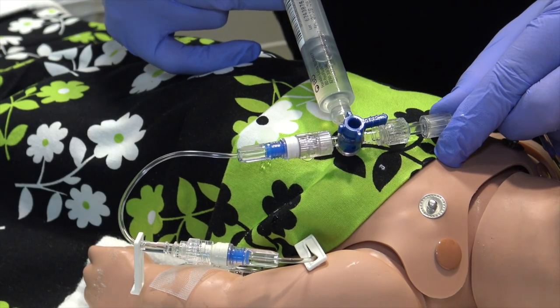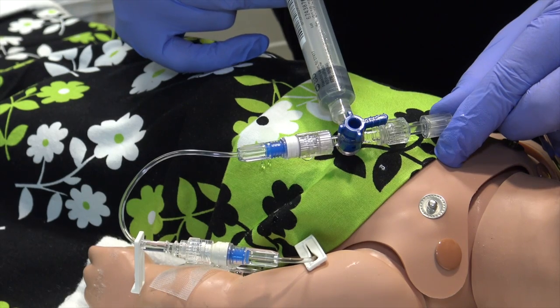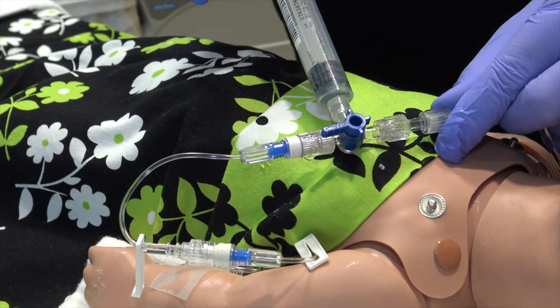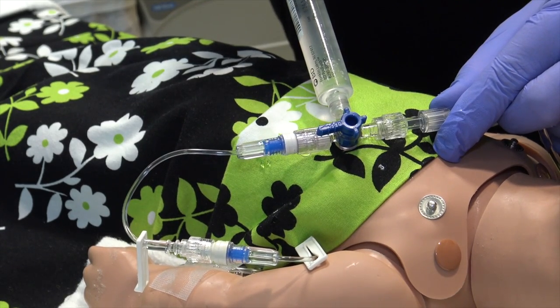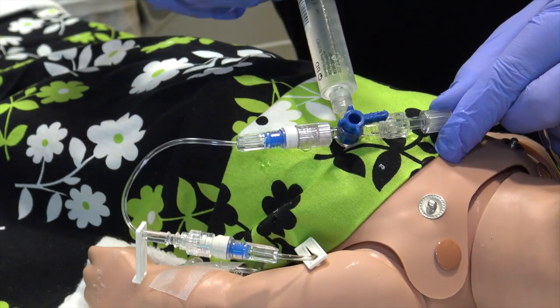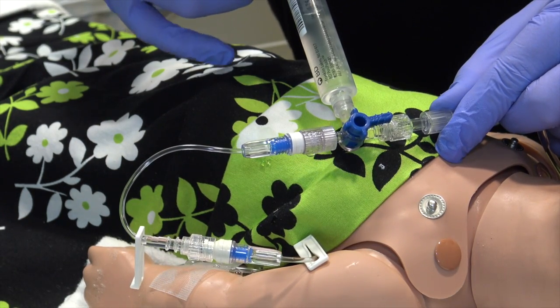If I need another 10 cc syringe once this is delivered, I turn it off again to the patient, withdraw the appropriate amount of IV fluids, turn it off to the IV fluid bag, and deliver my fluid bolus.